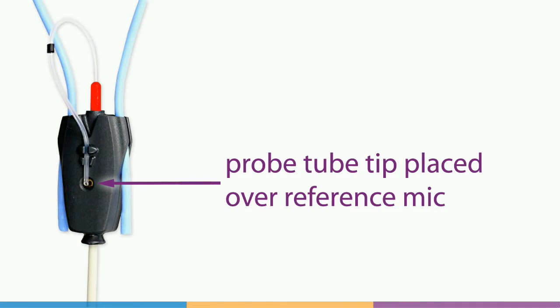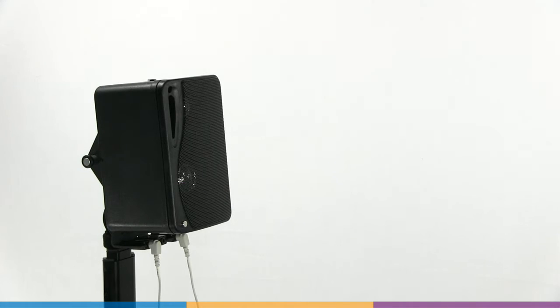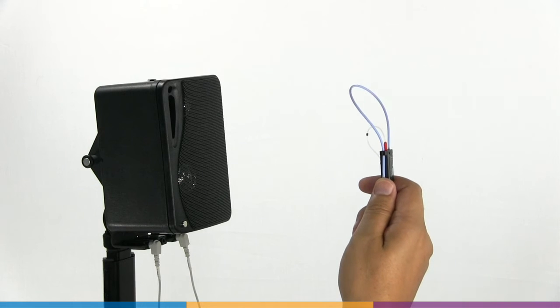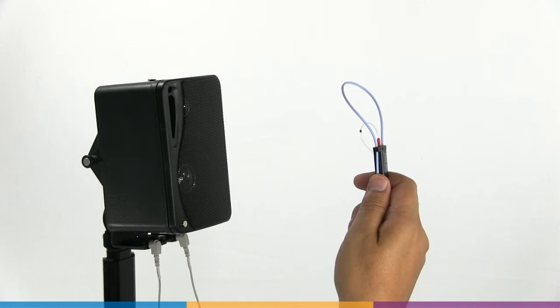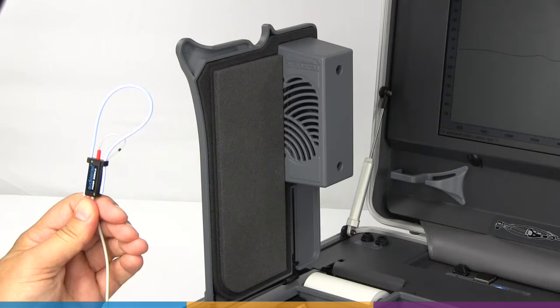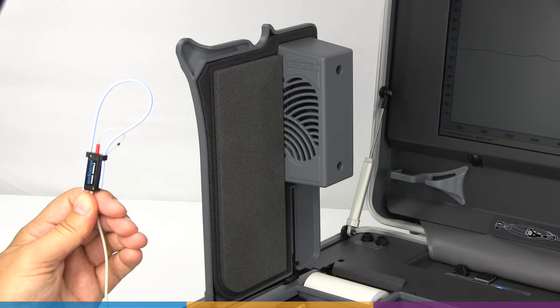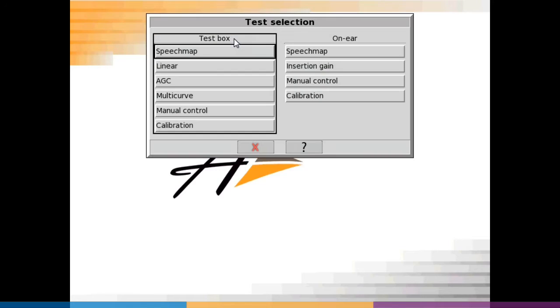Hold the probe module up with the reference mic facing the REM speaker. Distance is not critical, but we recommend 15 to 90 centimeters or 6 to 36 inches from the speaker. From the tests menu, choose on-ear calibration.